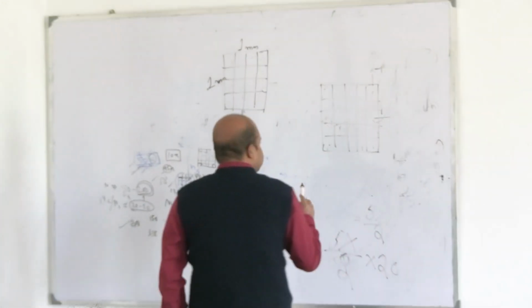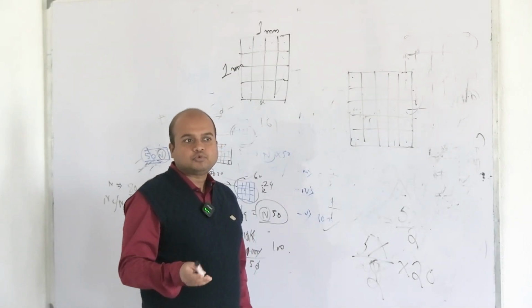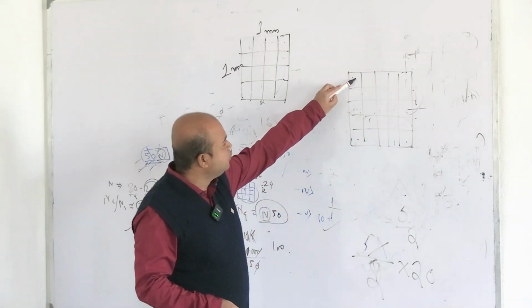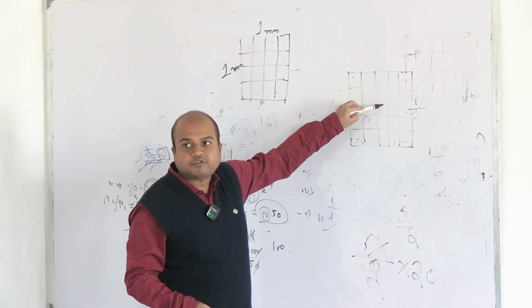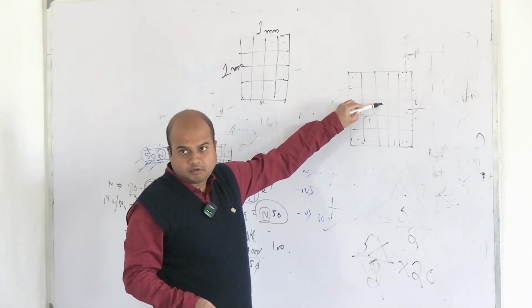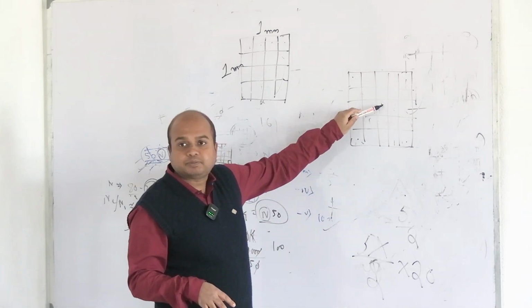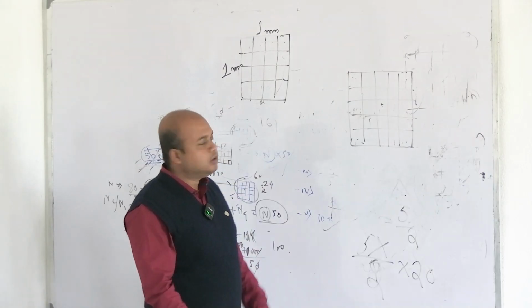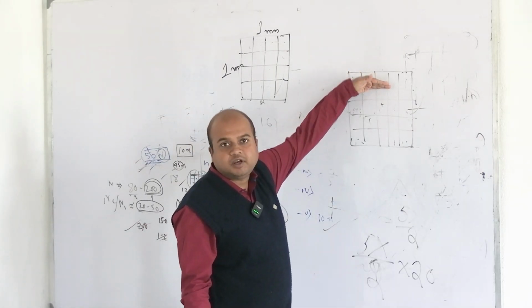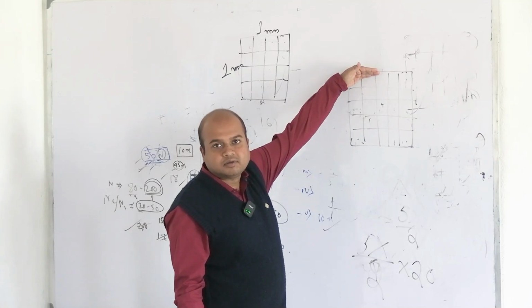So as we are considering uniform distribution, perhaps to corroborate that, we find that whatever density of cells will be there in the corners, that similar density of cells would be expected in the center. If it was not uniform distribution, only this part of the grid has filled up, this part has not filled up, so we have to count these cells.